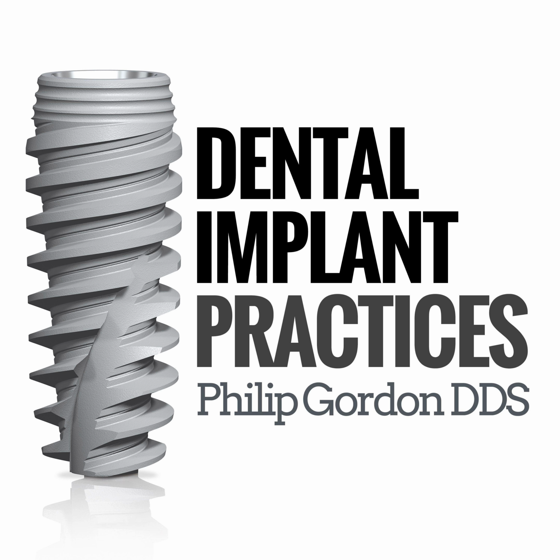So that way the shape of the drills can be the shape of the implant. So they're stepped to accommodate the taper design of the implant. So that way you're achieving that primary torque that we're talking about, the primary stability.